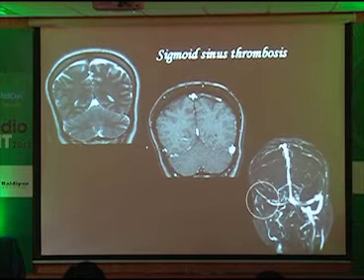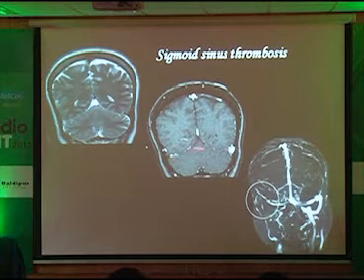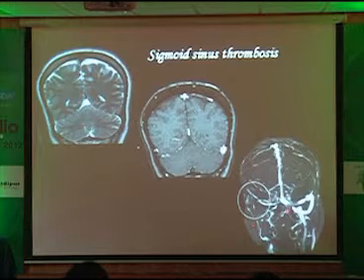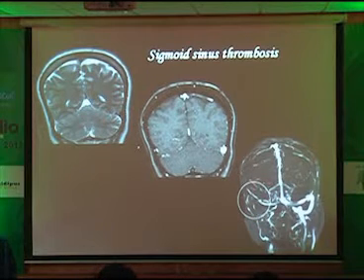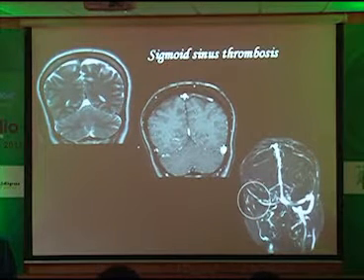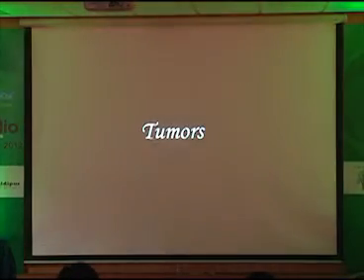Looking at MR: you can do an MR venography. Similarly, you do not see enhancement within the right sigmoid here. The left sigmoid is enhancing, and MR venography shows no flow within the sigmoid sinus. So you can pick up dural sinus thrombosis extremely well with CT or MR, preferably MR.